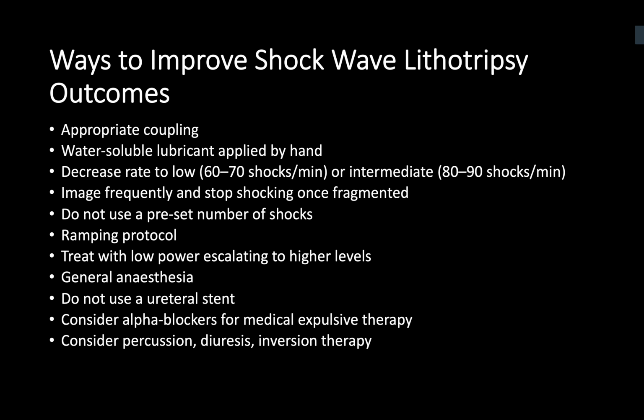All right. How can we improve the outcome of shockwave lithotripsy? So this can be improved in a number of methods. You need to ensure that the patient is adequately analgesed prior to the procedure, commonly with diclofenac suppository. The frequency of shockwaves should be commenced at 1 per second. And during the procedure, this can then be ramped up, with the energy ramped up as well. The energy can be ramped up in the power.